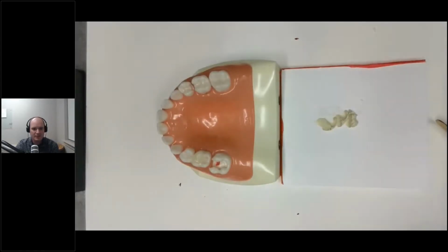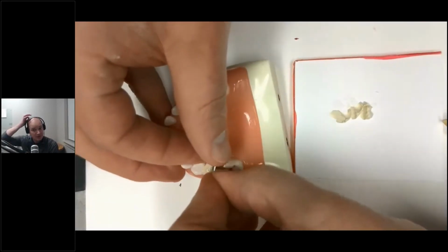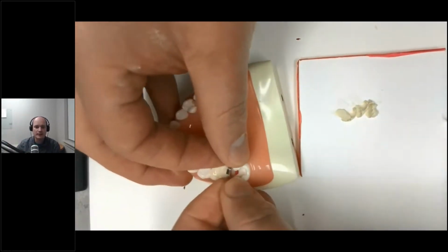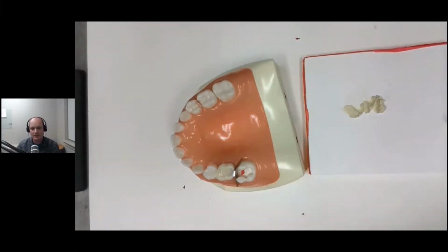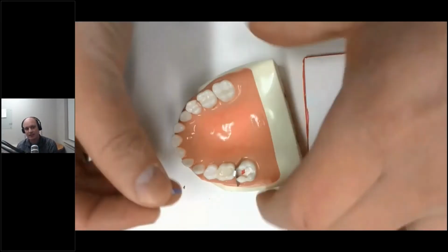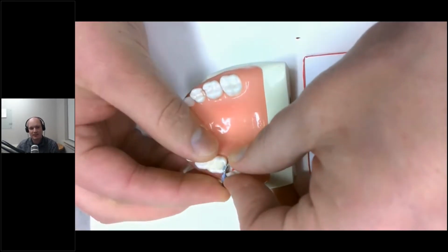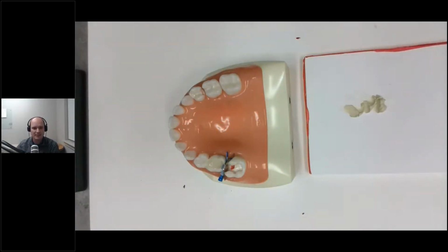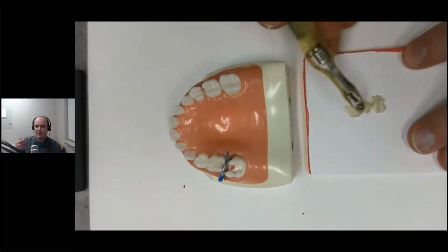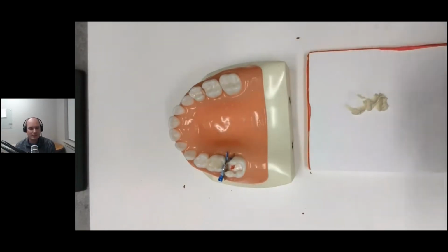This would be a situation where we have a large carious lesion and we have a pulp exposure on a kid and we don't want to do endo. One of the things we can do is have a very nice aesthetic outcome depending on the carious risk for using this system. So you can go ahead and place your ring and then place a wedge. I like to hold that matrix in place. You can place it with one of their applicators or your fingers or cotton tip applicators.